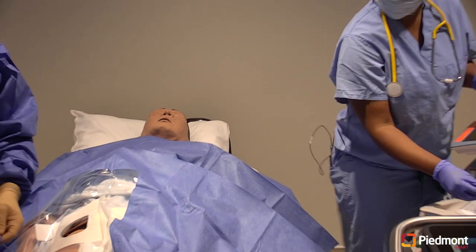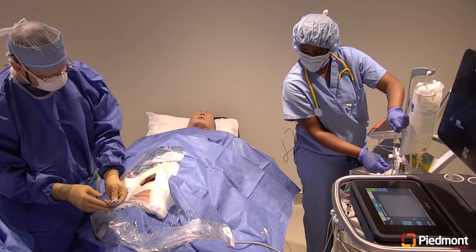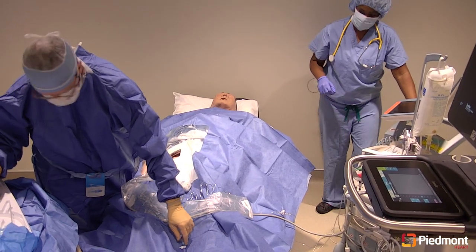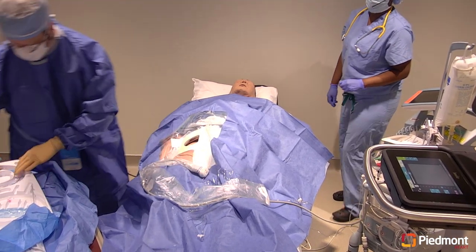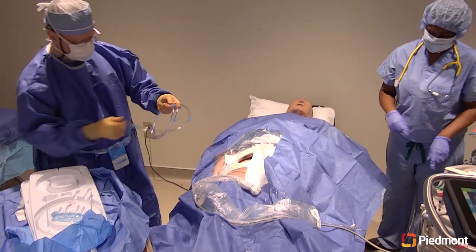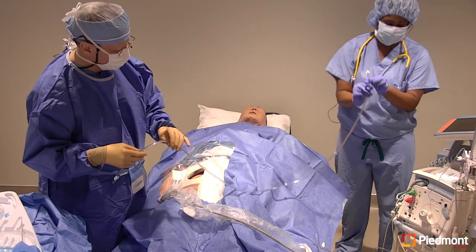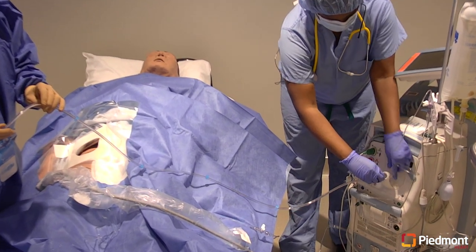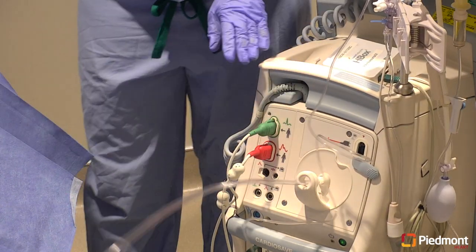Can I flush? Sure. Flush at the direction of the provider. Okay. And off. Okay. Give you your gas line. I'm ready. Thank you. Connect the helium tubing and fiber optic cable to the balloon pump. Connect it. Okay.